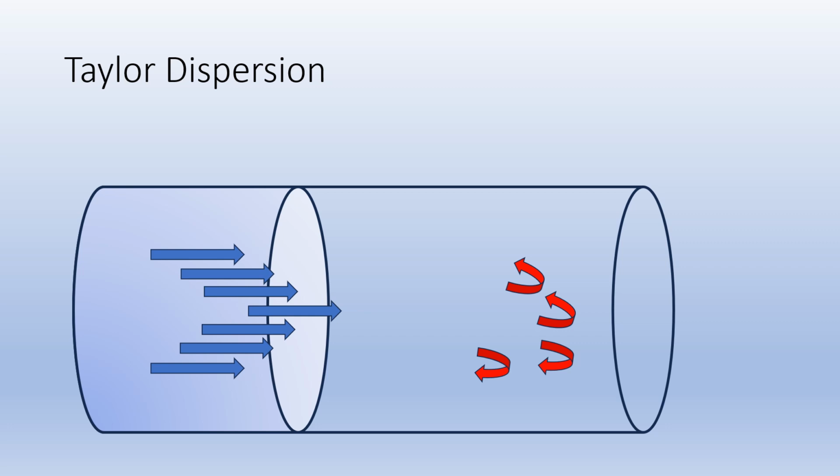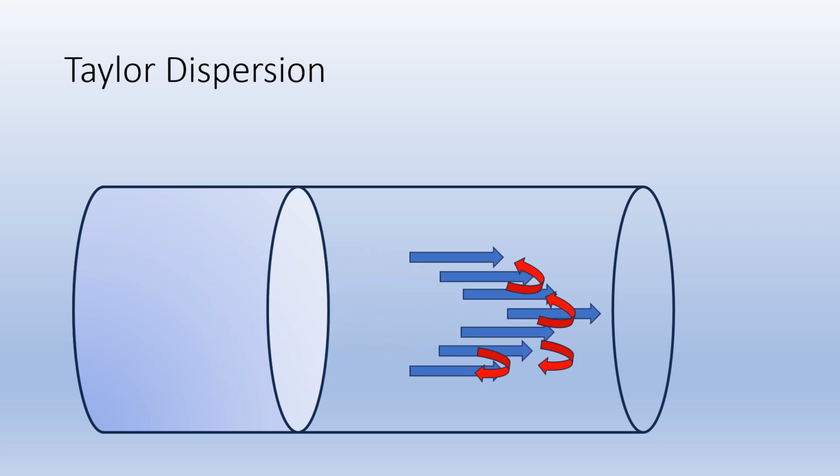Taylor dispersion explains the interplay between convection forces and molecular diffusion. As high-flow fresh gas pulses are sent down the airways in a convective stream, the stale or slow-moving exhaled gas is displaced to the outside of the fresh gas stream along the walls of the cylinder, in a swirling motion called a double helix. This allows the jet pulses to penetrate deeper into the bronchial tree, allowing for ventilation of the distal alveoli, while minimizing the effect of dead space gas. Some of the fresh gas mixes with gas present in the alveoli, allowing for gas exchange with very low tidal volumes.